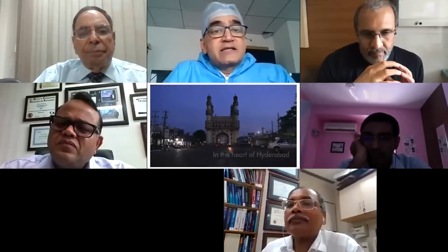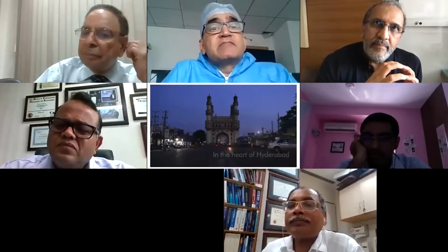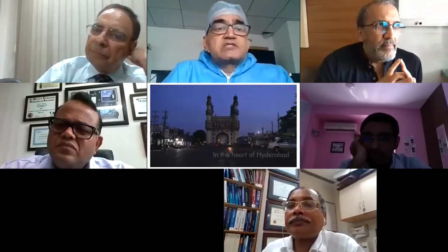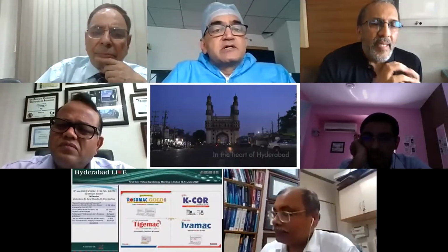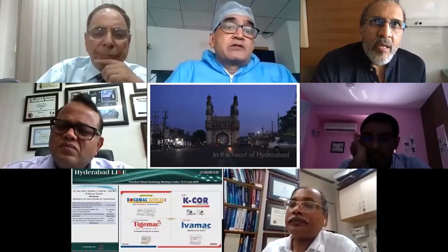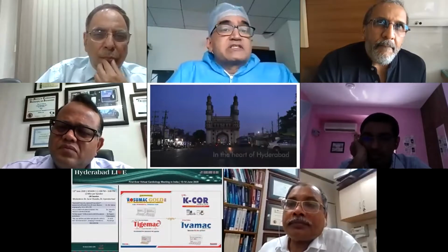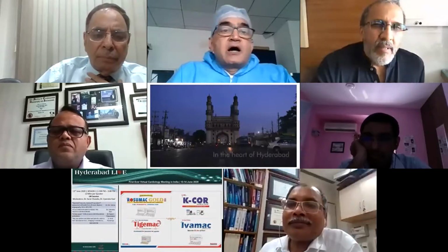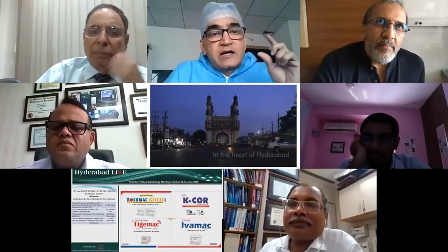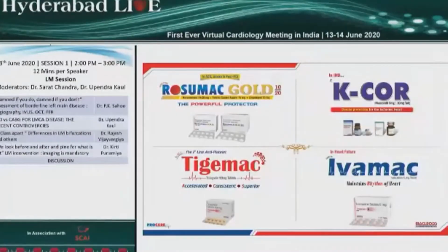The EXCEL IVUS sub-study, Kirti, I'm sure you have also gone through it. The deformity of the stent, especially at the ostium, is one of the predicting factors for short-term as well as long-term MACE. And the predictor for the stent deformity at the ostium was the use of an 8 French guiding catheter. I'm not saying it should be completely avoided, but one has to be very cautious while pushing the guiding catheter too much inside the LM, especially after the stent has been implanted. Sarath, I will answer this question in 1 minute.